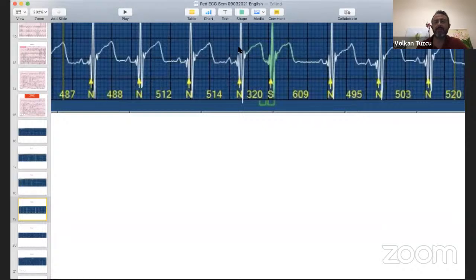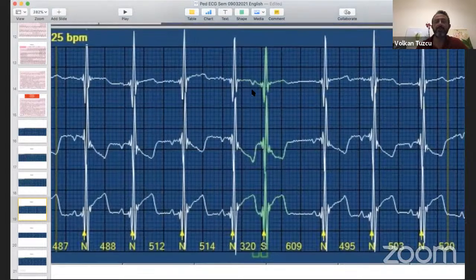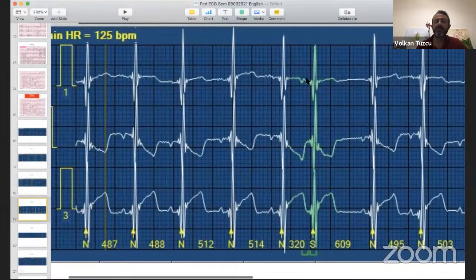I can be a little suspicious, but I cannot say. But if somebody shows me this, then I can, because look at this. But what if this is artifact? Like the previous comment I made, if this is artifact, it shouldn't recur the same way. That's how we differentiate. Look at the previous areas during sinus, the ST-T segment: even though there's some variation, we don't have a notch like this. But what if this notch is coincidence coming from this extra beat?